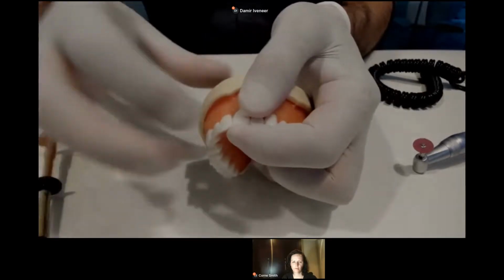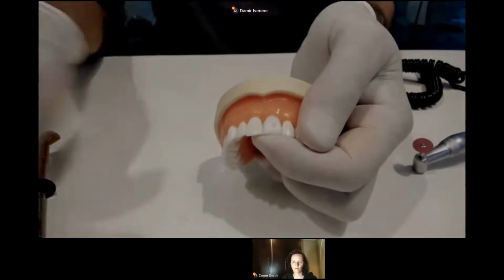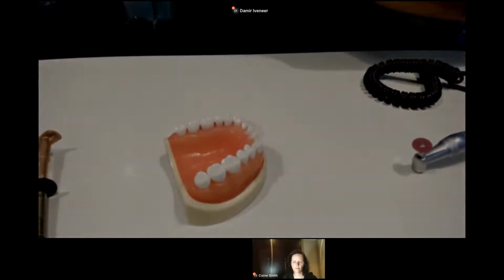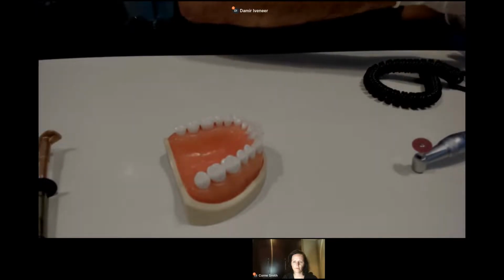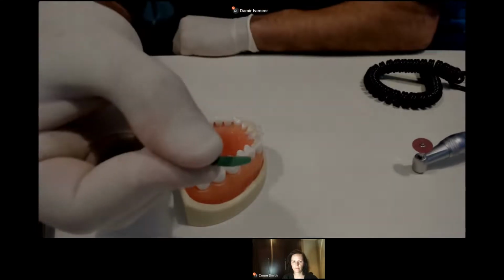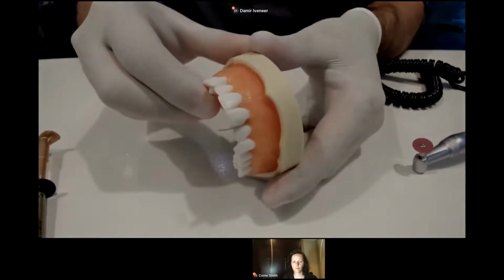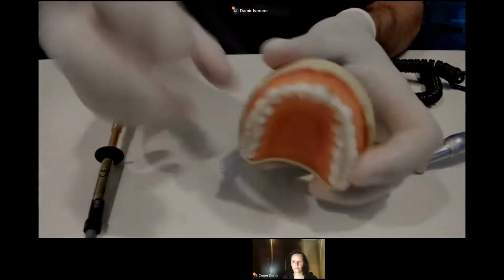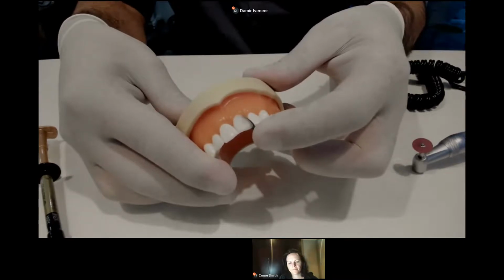Till we finish. And then we go out and we cure the material. Now, if we cure the material and we take out the matrix and there is still a small gap, then we can use a very, very thin sectional matrix, and we can put the sectional matrix in this way, and again inject the flowable composite with the brush and cure it again. But once we put the sectional matrix, we push a little bit with our finger to create the contact if we need it.